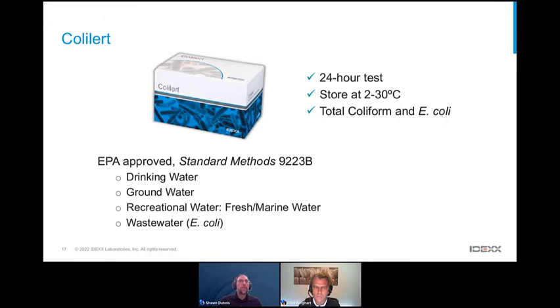The water matrices that it's approved for include drinking water, groundwater, recreational waters, both fresh and marine, and then finally wastewater testing for E. coli only.